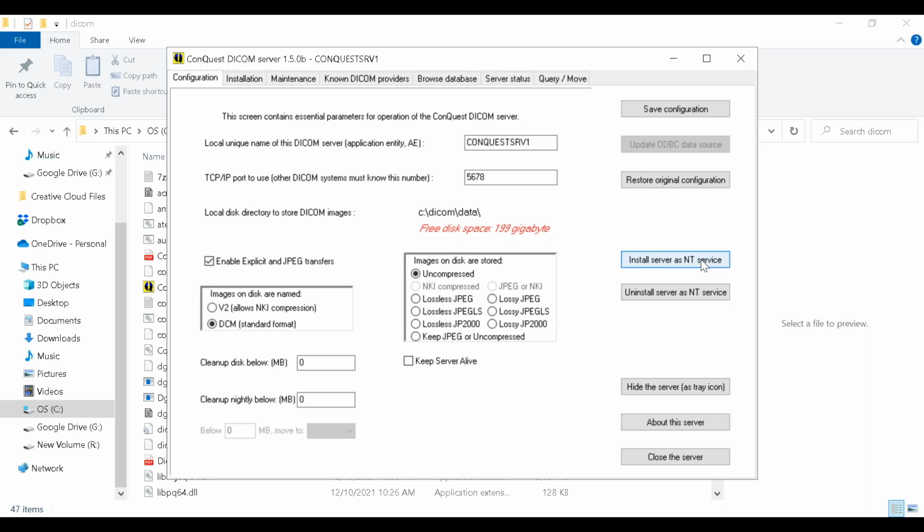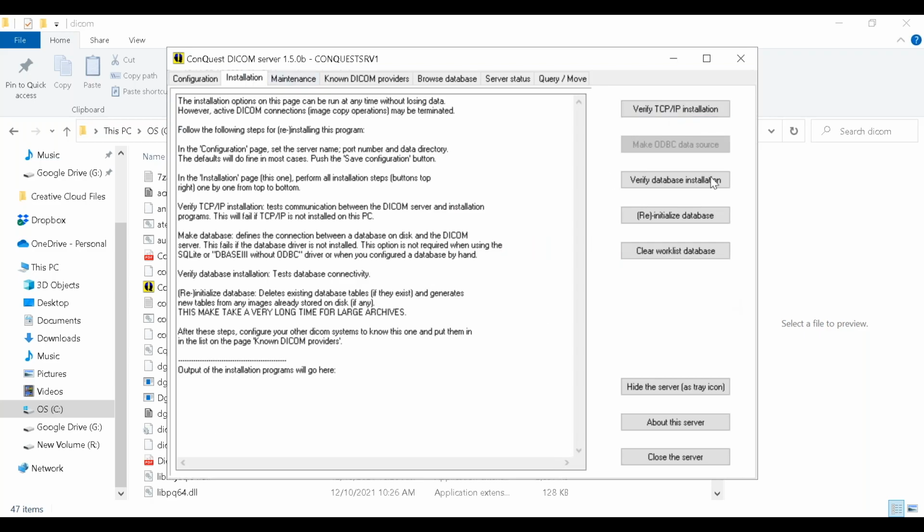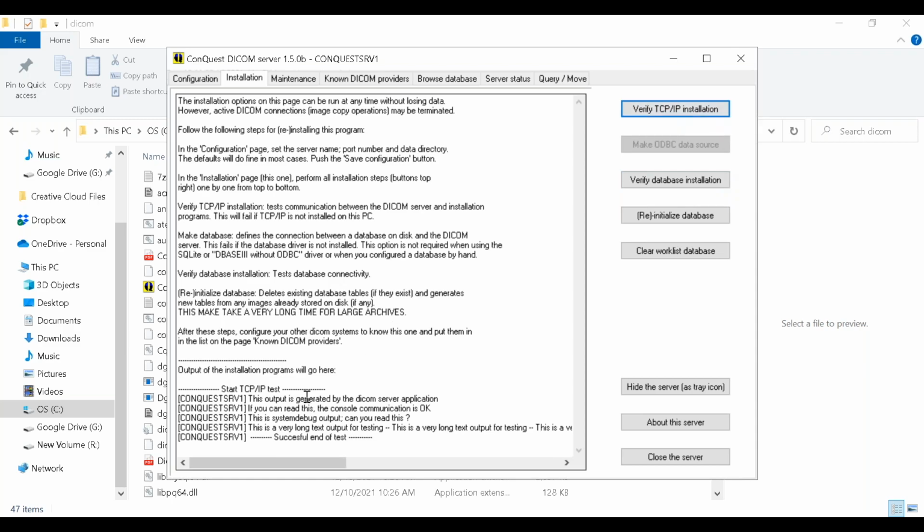I find that it runs better if you go ahead and install it as a service. It becomes a process running in the background. For those of you who've studied computer operating systems, you'll remember that a service is essentially a process that is a part of Windows. So it becomes a part of Windows. After you're done with that, I'd like you to go over to the installation files. I'd like you to verify that your TCP/IP installation and your database installations are correct. And that's just as simple as hitting a button, and then it gives you a readout here.